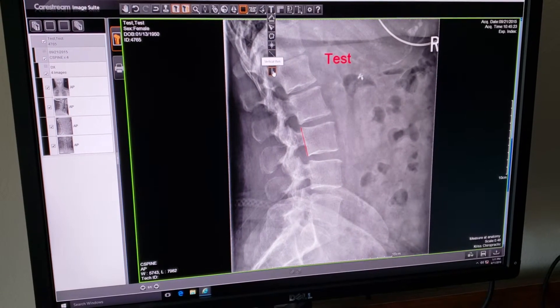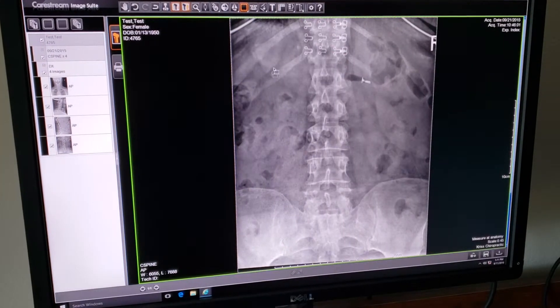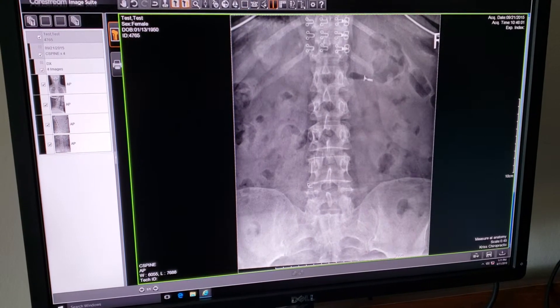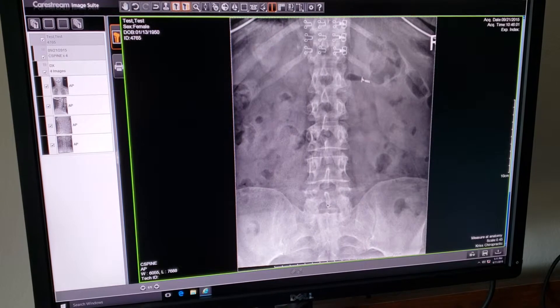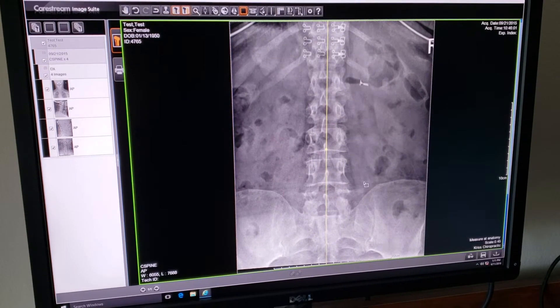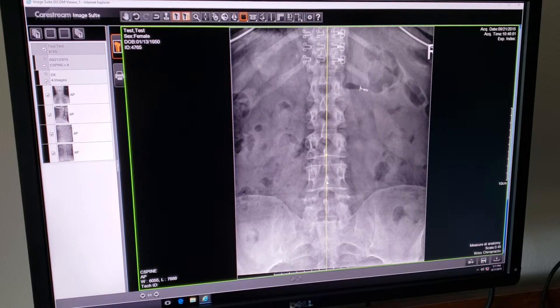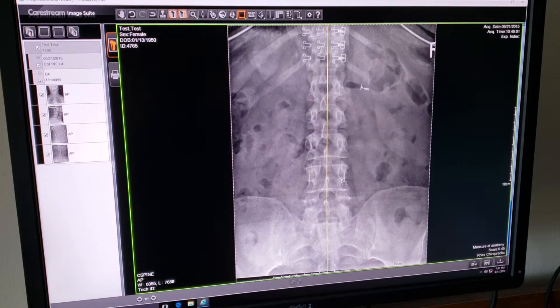Last but not least within this toolbar is the vertical axis or gravity weight line. If you would like to show a perfect gravity weight line, click on the vertical axis, pick your point, and click — it will place a perfectly vertical line. You can move it if it's not placed perfectly, then click one more time and it will stay.